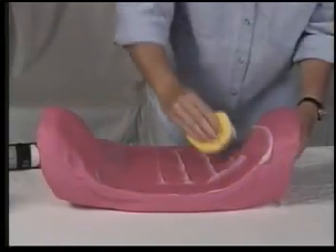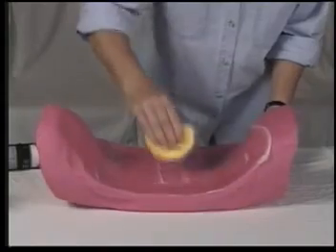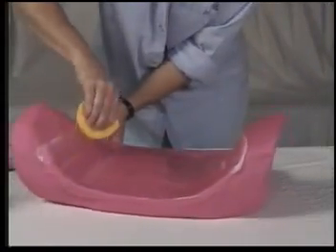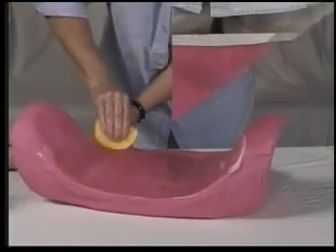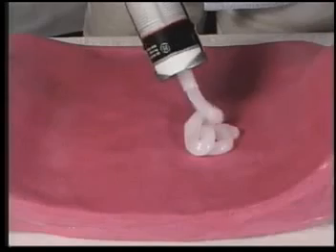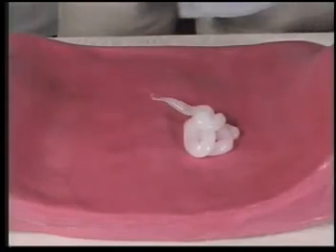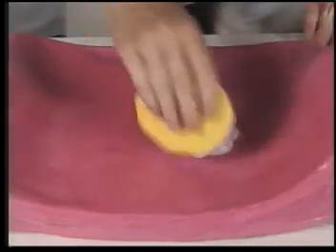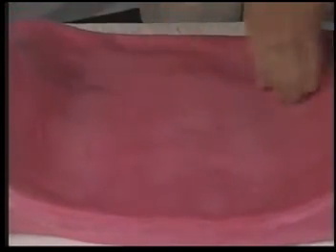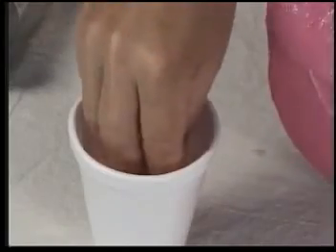The silicone coating provides an elastic waterproof seal which is permanently flexible and allows the insert to stretch and compress in a comfortable manner. After the first coat has set, in about an hour, apply the second coat. Use just enough silicone to make a smooth, consistent waterproof finish. While the second coat is still wet, it can be smoothed out by gently rubbing the wet silicone by hand with soapy water to eliminate any ridges.